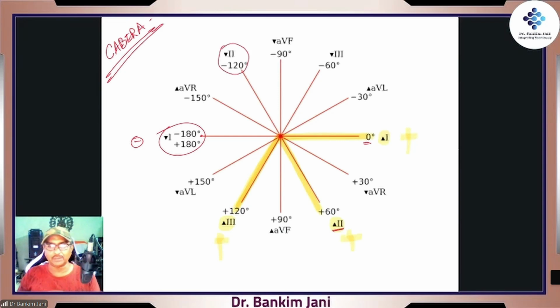So this will be the opposite one. See, all of them, their total would be 180, because that's the gap, the total. So this is lead 2, but it is on the minus side. So this is done. This is done. This is done. This is 120. When it is 120, the opposite side has to be minus 60, right? Because the total is this. So this is also done.